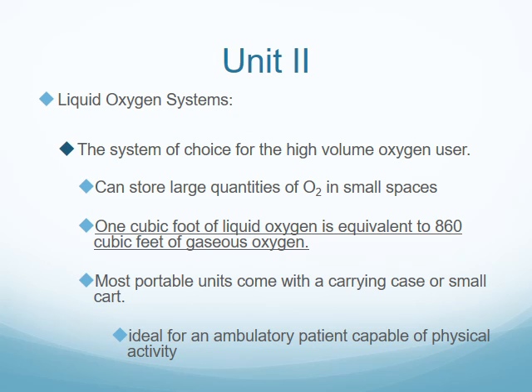Next, I'm going to talk about liquid oxygen systems. This particular system is very costly, and it's one of the systems of choice for a high volume oxygen user. So someone who has a lot of oxygen requirements as far as the frequency of oxygen usage, this will be more ideal. However, it does cost more than a typical oxygen tank.